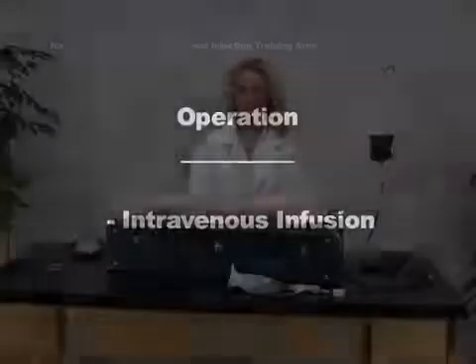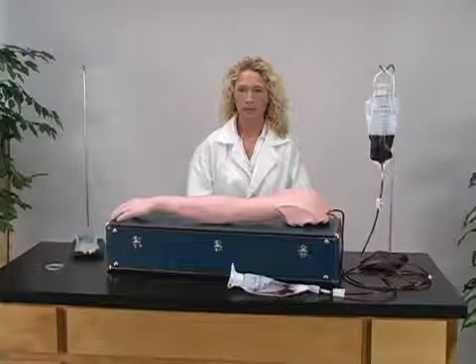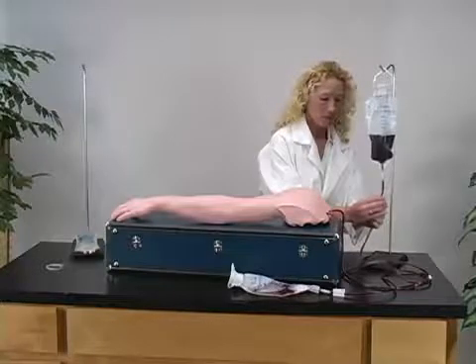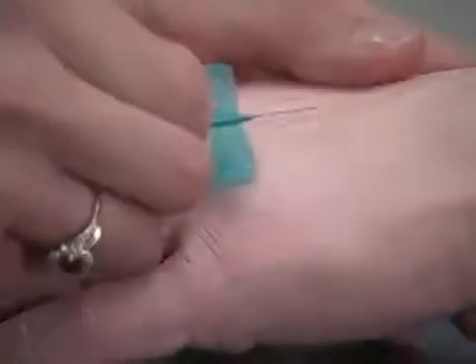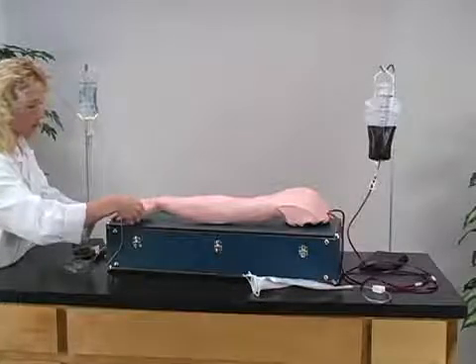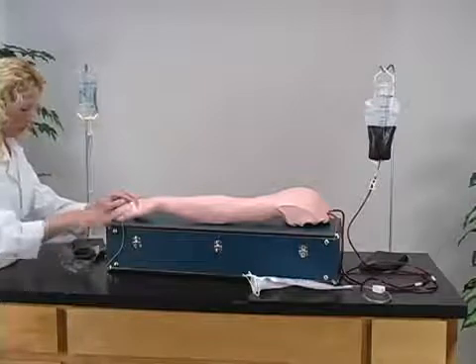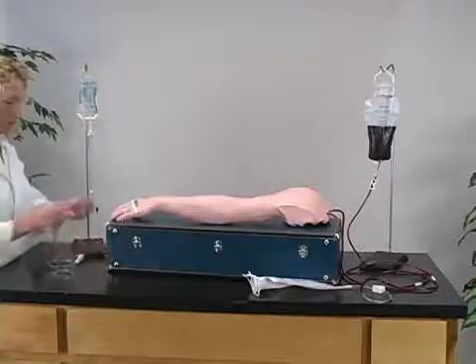To perform intravenous infusion, begin with a fully pressurized NASCO lifeform IV arm. First, regulate the top clamp slightly open. Now insert the infusion needle inside the vein. You will receive a realistic flashback in the infusion needle when it is properly inserted into the vein. IV infusion can be performed along any vein on the arm.